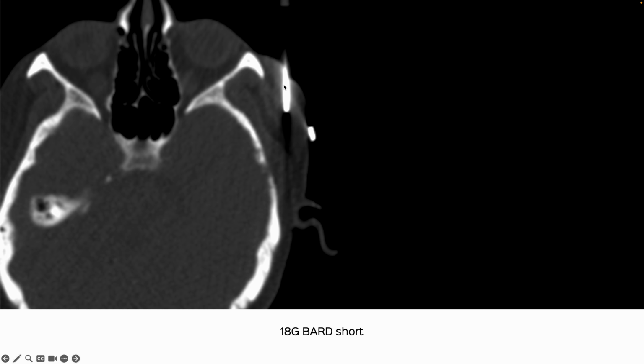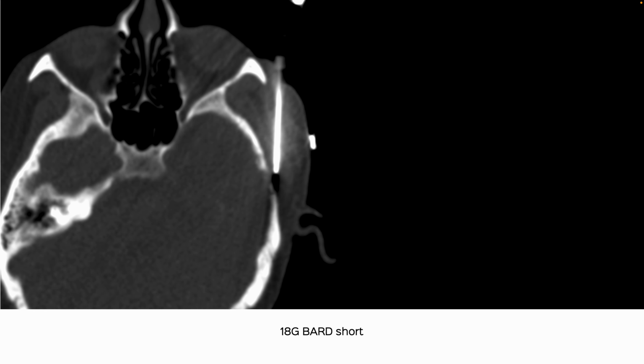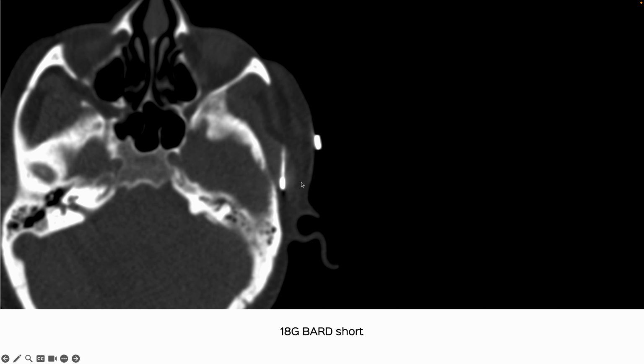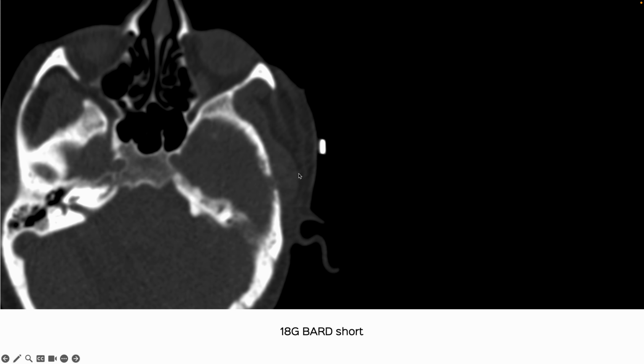The initial idea was to just use a 10 millimeter throw, but eventually I used the entire throw as well. You can see it going in. We had given a little conscious sedation. Here I am adjacent to the osteolytic lesion, and since you're parallel, there's no way you're going to go inside. Here I've deployed the gun and biopsied this, initially with the 10 millimeter throw, and now I've used the 20 millimeter throw as well.